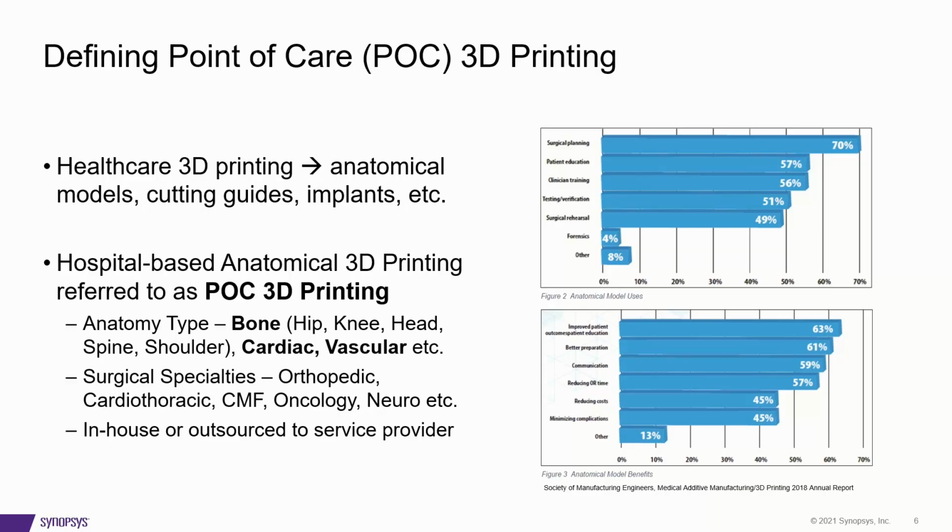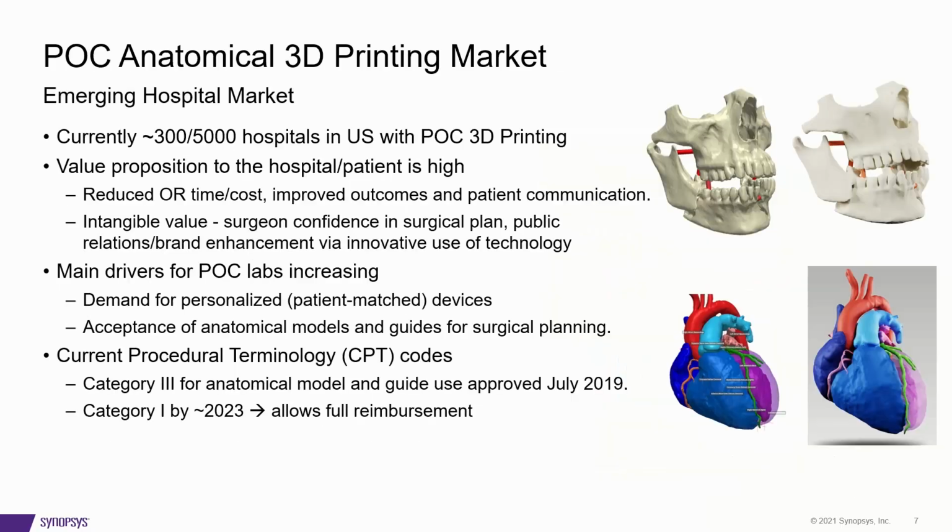Looking at the benefits of these anatomical models, it's improved patient outcomes or patient education, better preparation, better communication with patients, reducing OR time. Every minute you save in the OR will save you a significant amount of money, reducing cost overall, and then minimizing complications before falling into other categories as well. So we can see there's quite a bit of value from this.